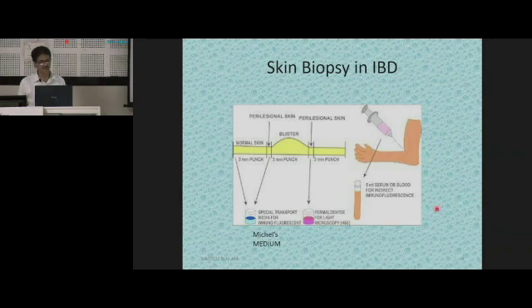Second is indirect immunofluorescence. For indirect immunofluorescence, you would require the patient's serum. Then there are certain chips and certain methods of detecting the antibodies, and they react with an animal substrate or normal human skin, and that's how the final pinpoint diagnosis of that particular condition is made.